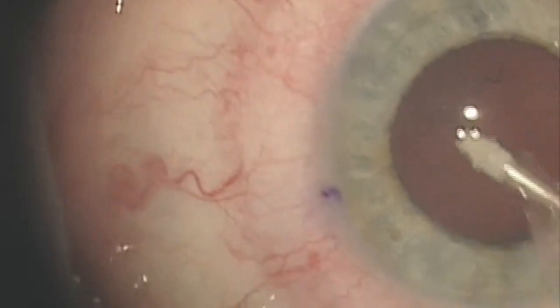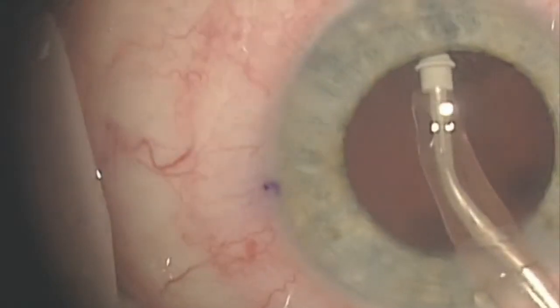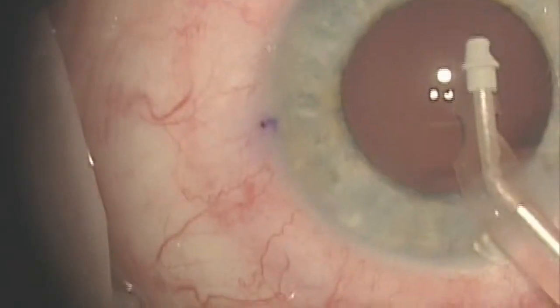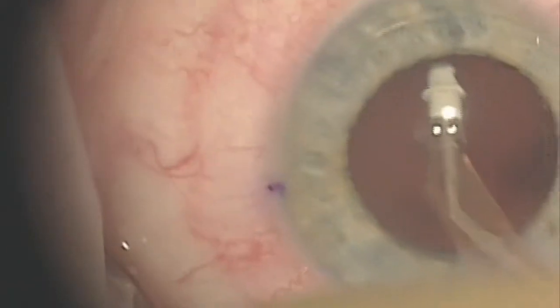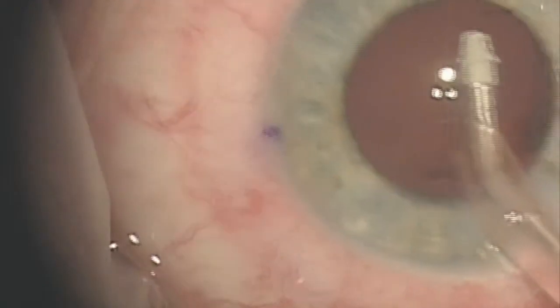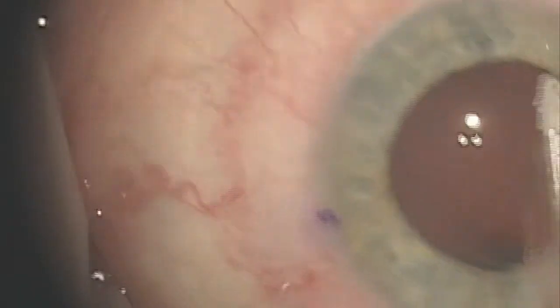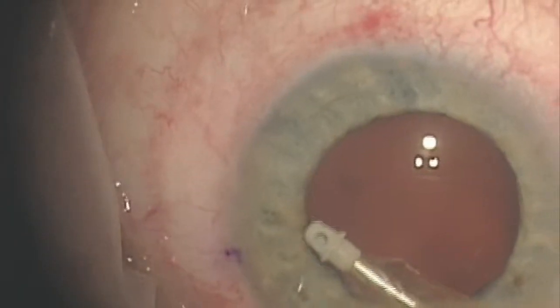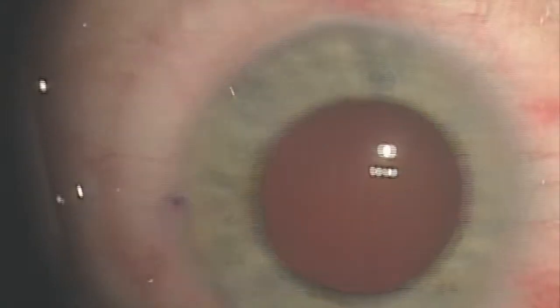Again, what is left is called the bag. And you can start seeing that opening coming quite clear in the bag. That bag right there. Okay, polish please. I'm changing my settings once again because I'm going to clean off my bag to get any little debris off of here because I want this as perfect as possible. We're now going to clean off that front part of the bag right in here.